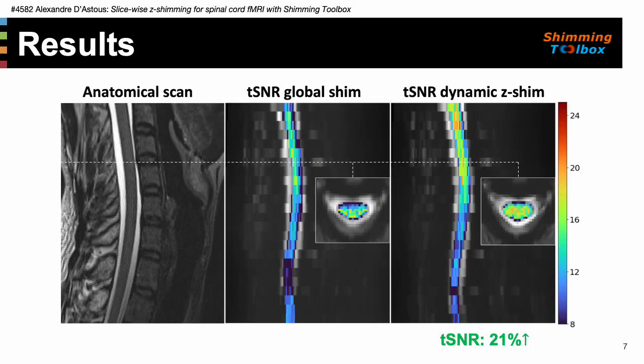We also compared the temporal SNR. The sagittal images in the figure show the T2-weighted anatomical scan for reference on the left, and the EPI of the global shimmed and slicewise z-shimmed acquisitions in the middle and right respectively. The tSNR was computed and overlaid in the spinal cord, and an axial cut was shown where a tSNR increase is visible. Across all slices and volumes, we measured a 21% increase in tSNR.